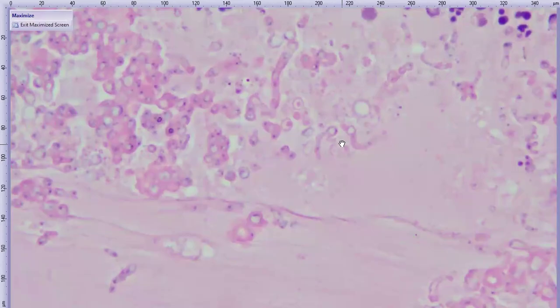So yeah, I also learned the word candidemia during this case. What a fun word that is, candidemia. So anyway, that is this case, which is a really unusual type of fungal organism, which we almost never see inside the eye. Did that answer the question?